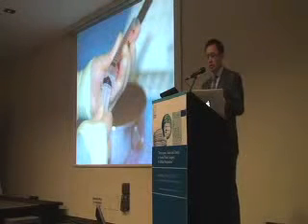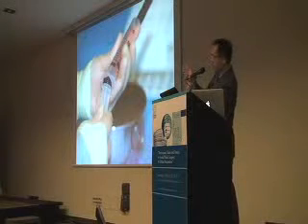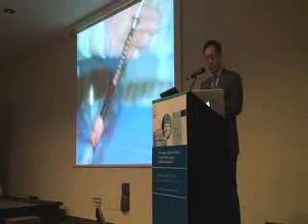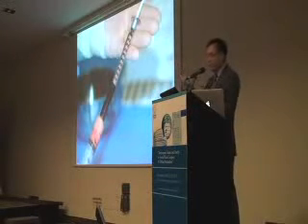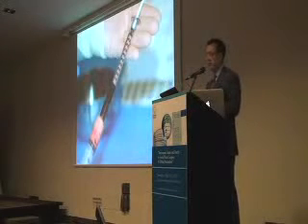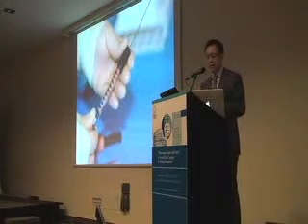And then the key with this, obviously, is you put it in the 25, you shake it down, let the air come out, and then push it back up so that you don't have fat spraying across the wall. Then you take out the air in there, and you just transfer into these 1 cc syringes. Make sure there's going to be an air bubble at the end. You want to push the column all the way out and then back in. I'll be showing videos of how to do all this in detail. This is a video that I shot that I'll be doing in Las Vegas. I just don't have the time to show you how to harvest and process, but I'll have that in Las Vegas at Dr. Waldman's meeting.